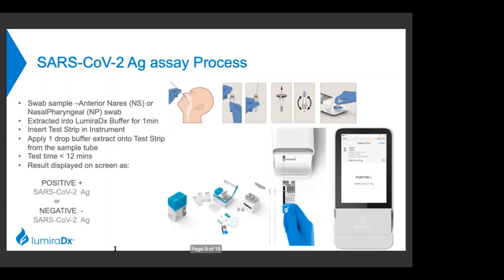Could I have the next slide, please? So this slide shows the SARS-CoV-2 antigen assay process. So the sample that we use is a nasal swab, the anterior nares, or we have recently also had data collected that shows the efficacy in nasopharyngeal swab also. We take the sample from both nostrils in the anterior nares, so both sides, just basically turning the nasal swab around in the nasal passage on both sides.